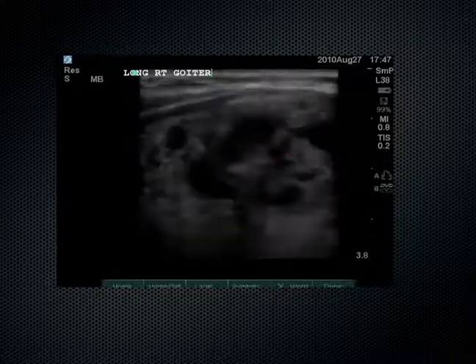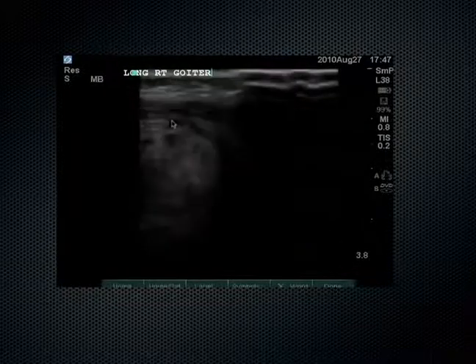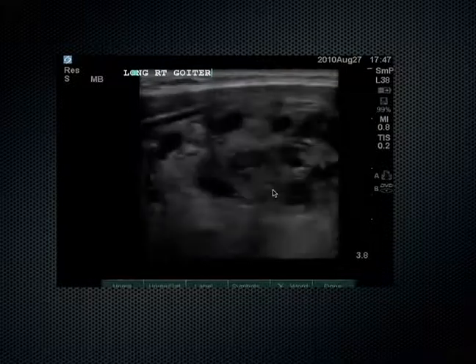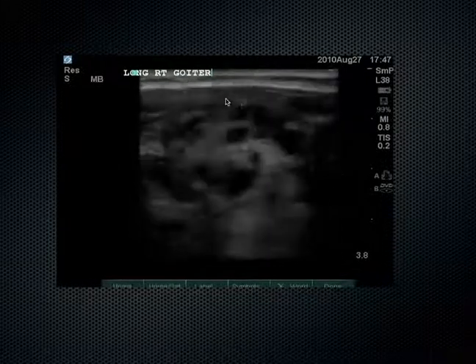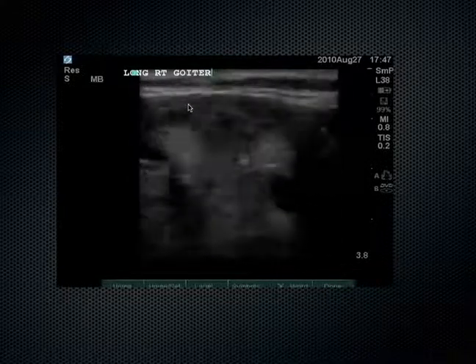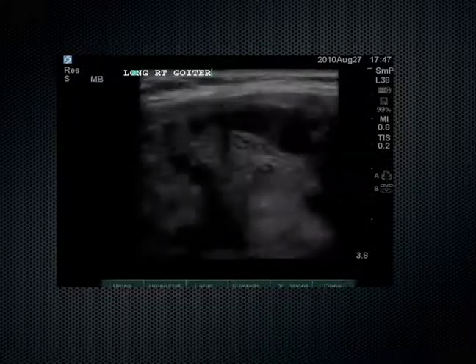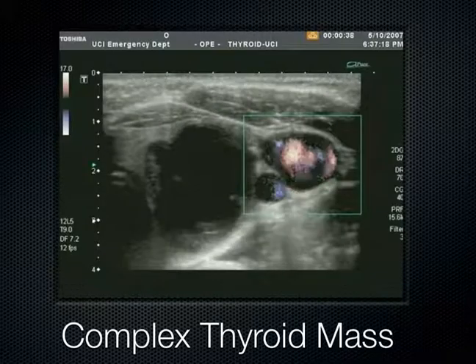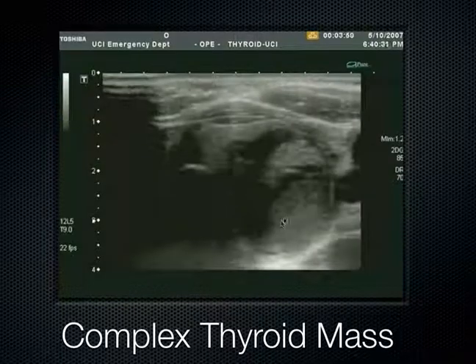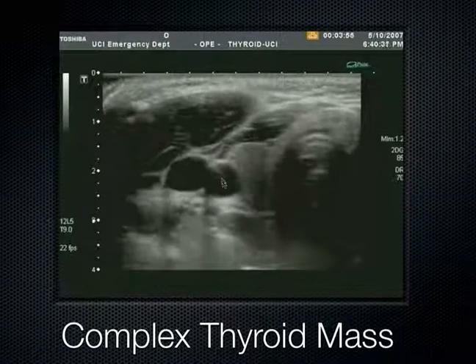Here's another patient with a large goiter — we're doing an ultrasound in our emergency department. We're seeing a very large multinodular structure that extends out across the screen. If they had used color on this view, you would see a really hypervascular organ consistent with a goiter in the setting of Graves' disease. And here's another one with a very large, complex thyroid mass — some parts are solid, some parts are cystic. We can see the vasculature in the neck: the carotid and IJ right next to the thyroid.